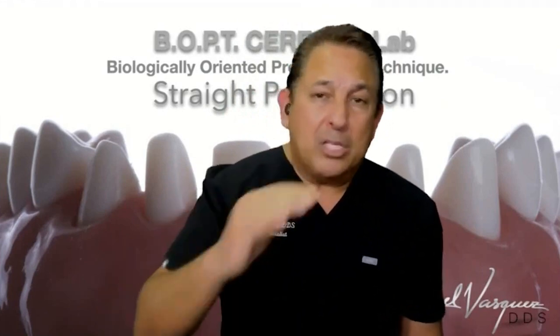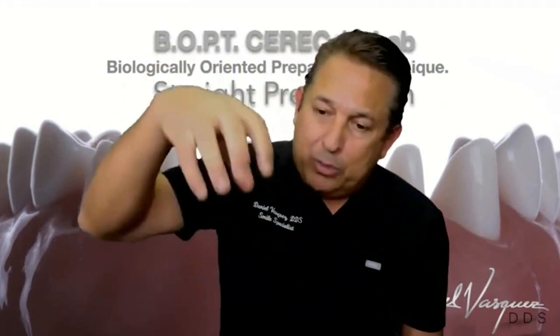So what do we do? We do temporaries. We polish these temporaries very nicely. So when we put the implant in, it's surrounded by the soft tissue, and what are we going to get? We're going to get very nice, beautiful tissue. So the day that we restore it and take impressions, it looks great.